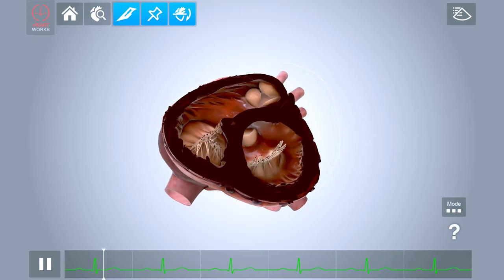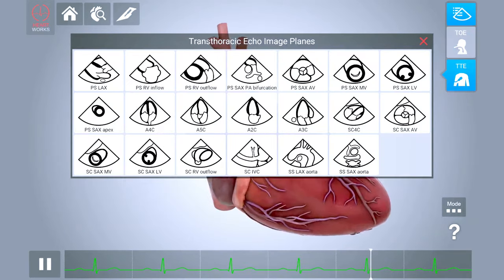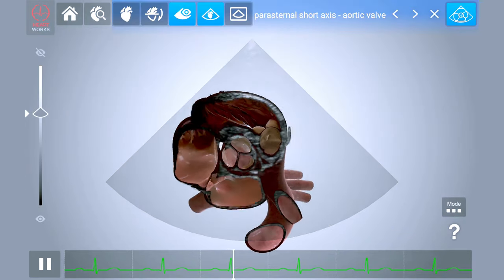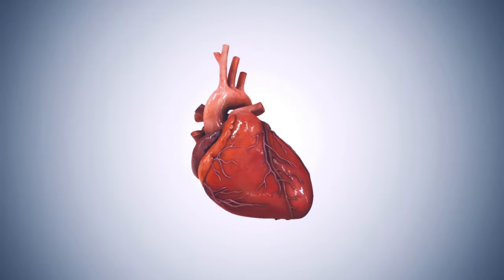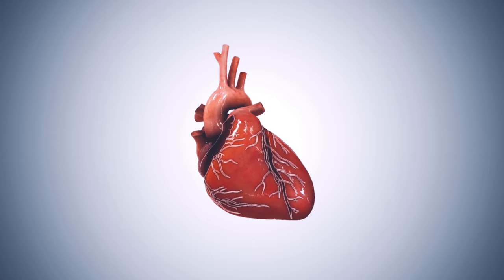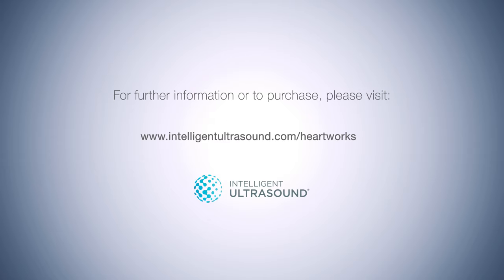The complete selection of standard imaging planes for TEE and TTE, essential when learning echocardiography, can be displayed within the 3D heart. HeartWorks AR is proving to be an invaluable tool for anyone wanting to learn more about cardiac anatomy and echocardiography.